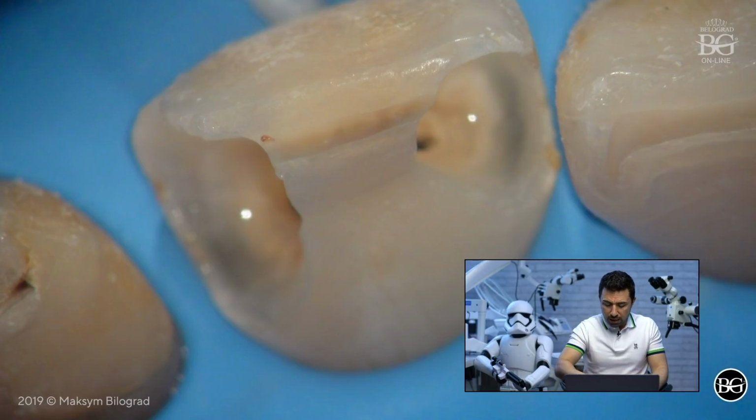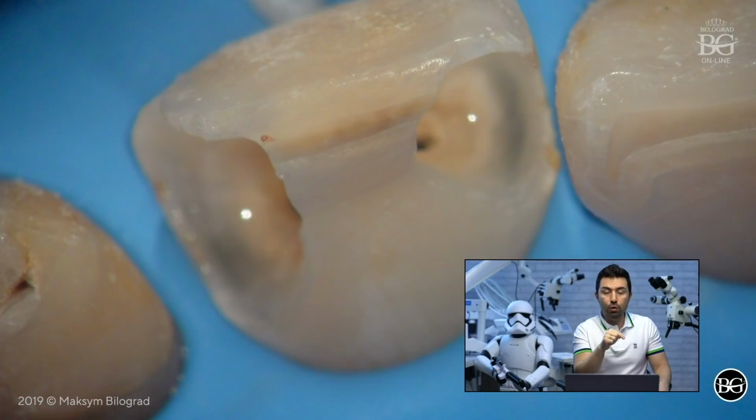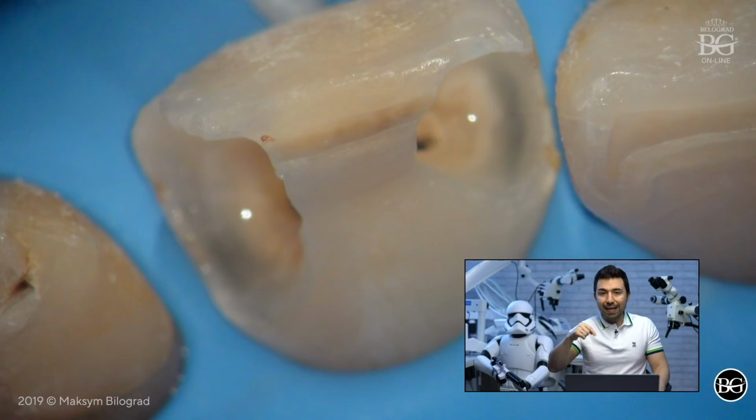But the message I would like to share with you is, don't try to do super minimally invasive access in every single case. Access has to be driven by the defect, and also by the next step of endodontic treatment. So if you cannot reach the root canal, especially in curved root canal cases, because of the access, you have to do a straight line. Otherwise you may cause file separation, you may create a ledge, and you may not complete endodontic treatment. So your access will be a criminal one. In this case, everything was super simple.